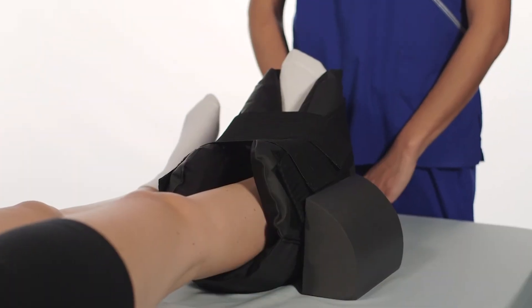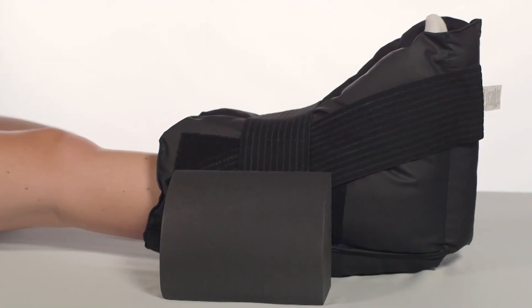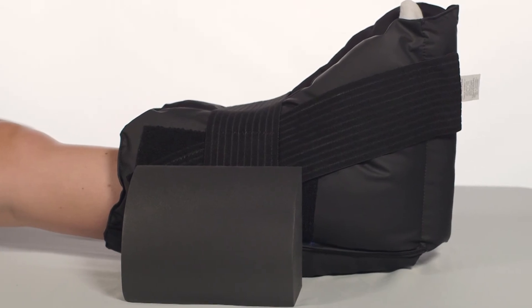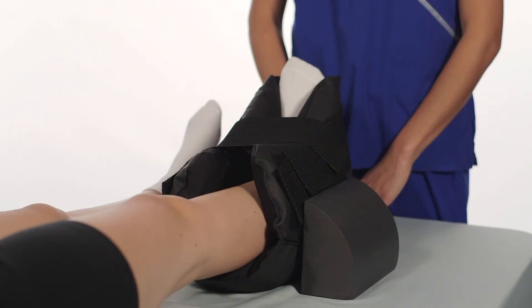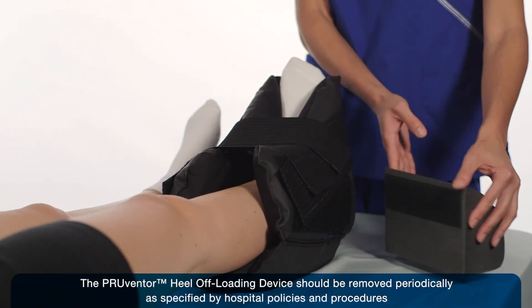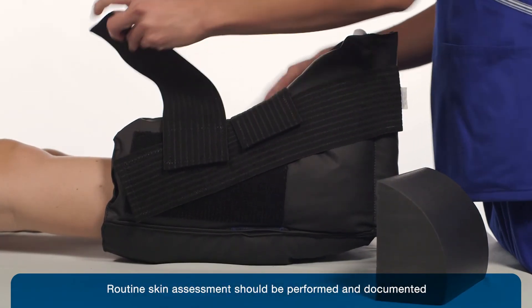The Preventor heel off loading device is for non-ambulatory patients and should be removed before ambulation. Do not allow your patients to stand or walk while the boot is on. To remove the device, simply detach the anti-rotation wedge and release the straps by removing the hook tabs.